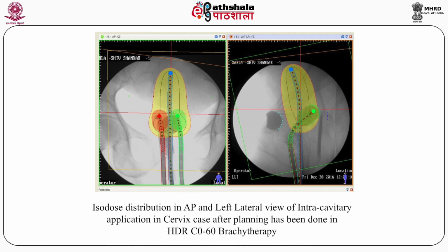In recent HDR machines where a cobalt-60 source is used, for safety purposes, certain laser welding is required while making the cobalt source, to protect the source from deterioration and damage. Stainless steel material is used in the applicator, and universal plastic tubes are used in these applicators, and the source moves in the universal plastic applicator.